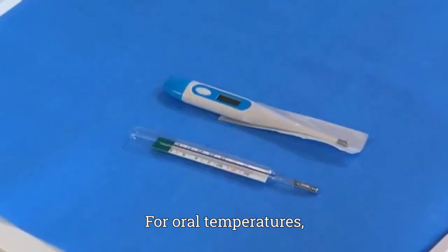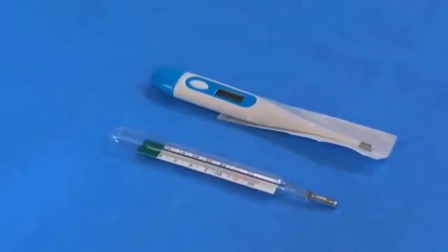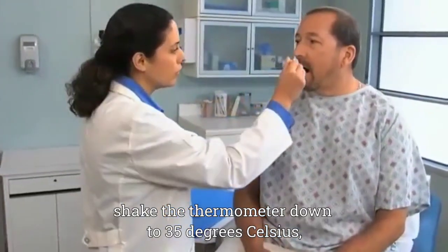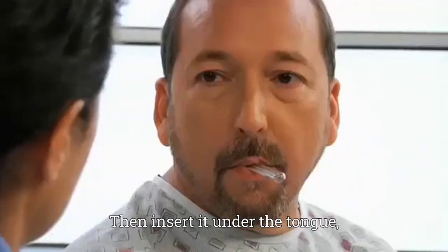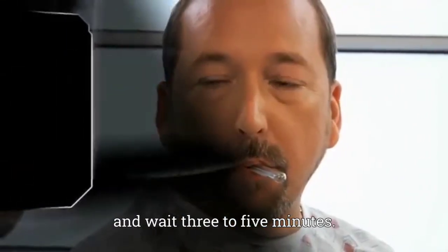For oral temperatures, choose either a glass or electronic thermometer. When using a glass thermometer, shake the thermometer down to 35 degrees Celsius or 96 degrees Fahrenheit or below. Then insert it under the tongue, instruct the patient to close both lips, and wait 3 to 5 minutes.